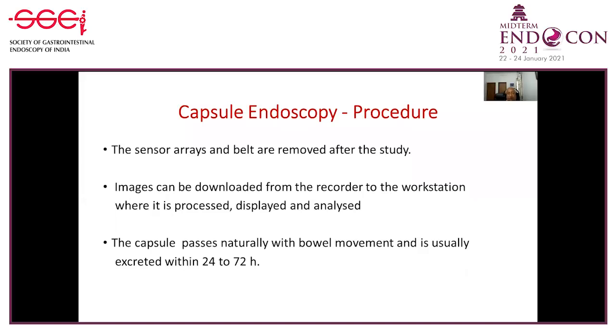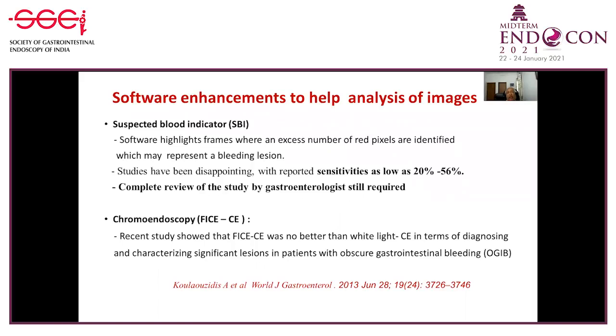And what about the capsule? It is a one-time use capsule and passes naturally with the bowel movement and is usually excreted in 24 to 72 hours. Are there any software enhancements to help analysis of images?